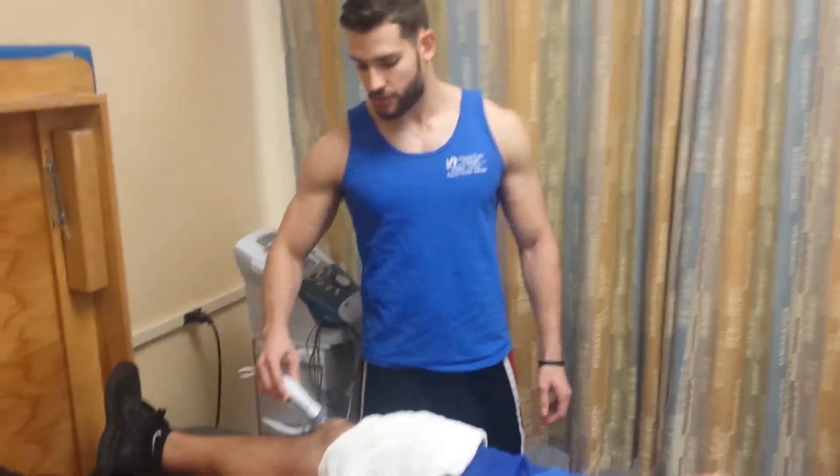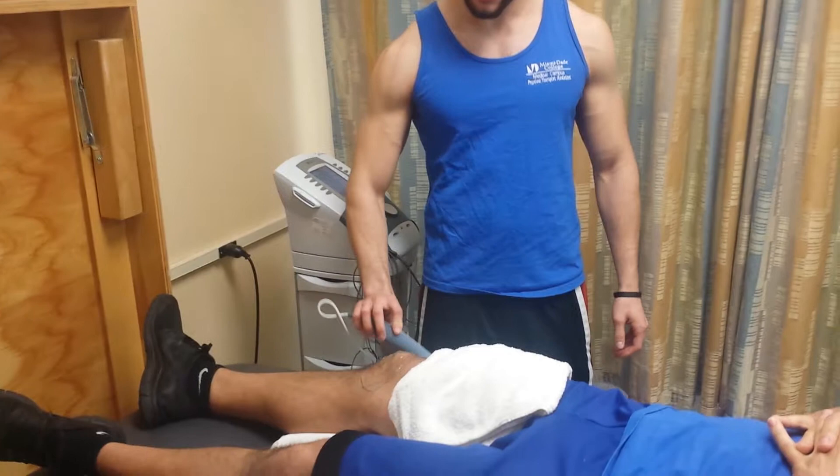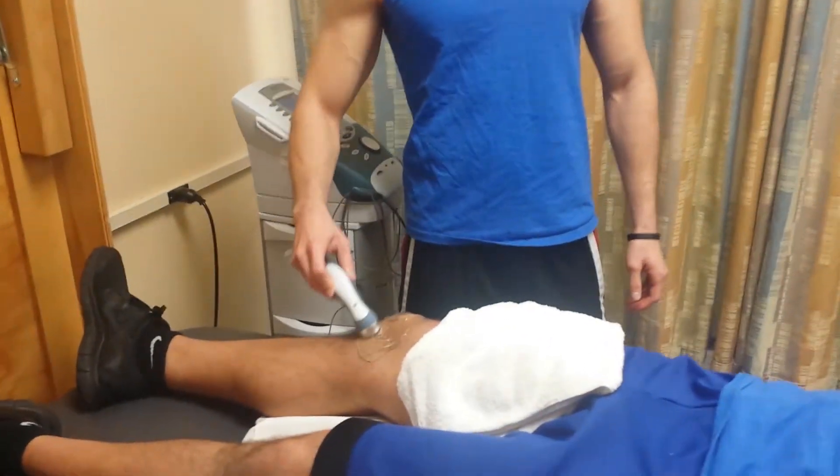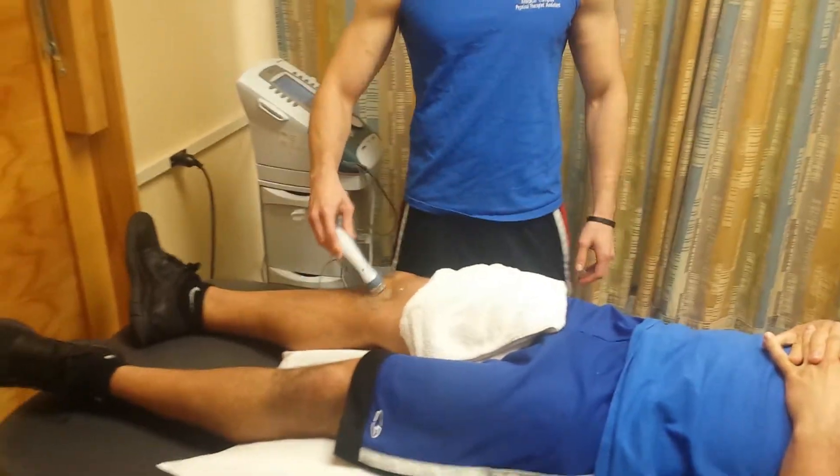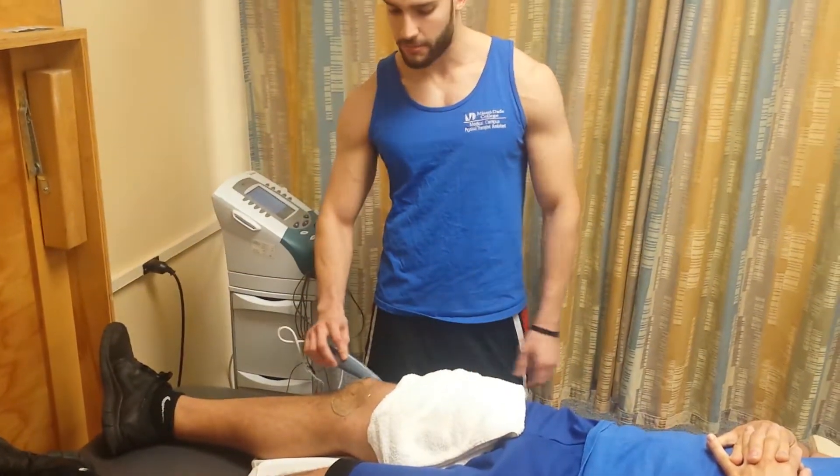So just reassess the area as you're treating the patient. Then after 8 minutes, the machine will shut down. That's the treatment time — 8 minutes.